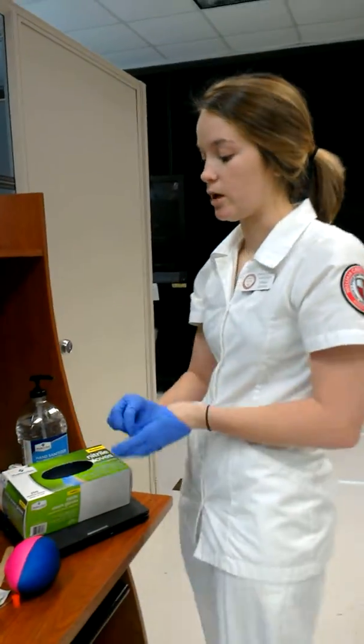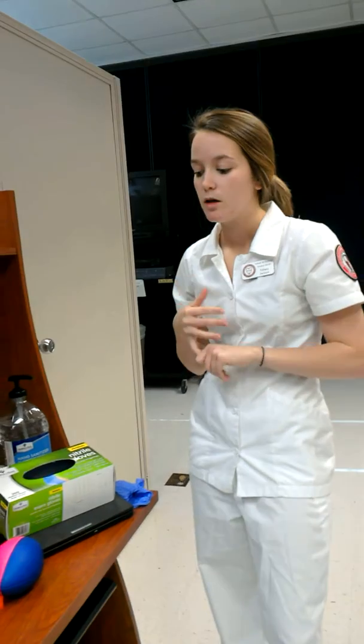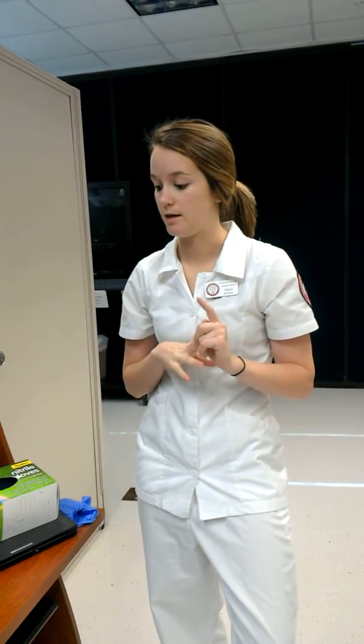So then I'm going to take off my gloves and throw them away, and then I'm going to document the amount of insulin that was given, the time it was given, the site that it was given, and how the patient handled it. And that is how you mix and administer insulin.